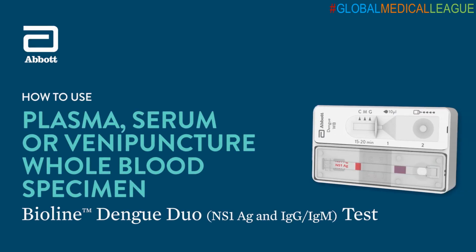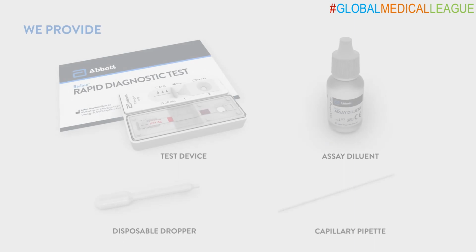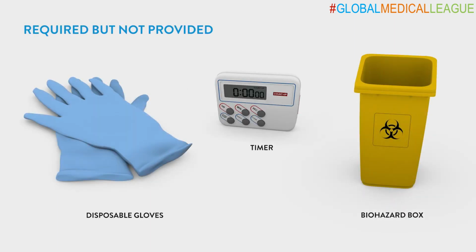This video is intended to train healthcare professionals how to use the Bioline Dengue Duo test kit. These components are included in the test kit. These components are required but not provided.